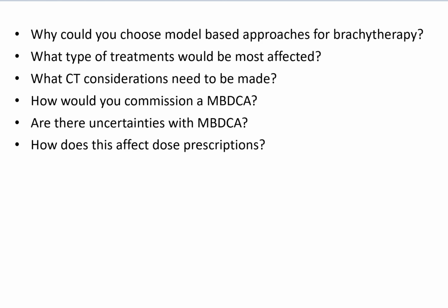So, like usual, every time we have a chance to discuss a task group or mention a reference, we are going to do that. And that is going to be TG 186. There we go. So you might want to consider a model-based approach for brachytherapy because TG43 is limited. It does not use a heterogeneity correction. It assumes everything is water, which we know isn't correct, but that's what we've done for years.